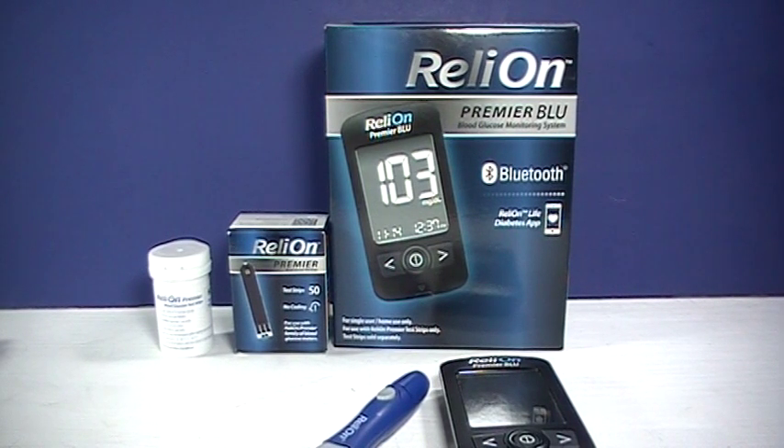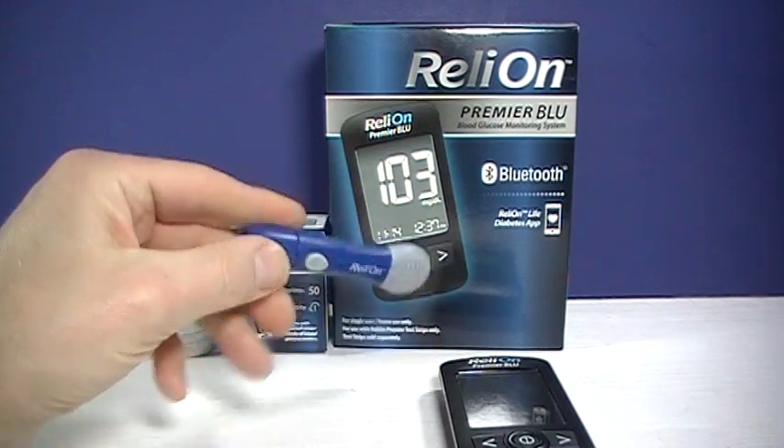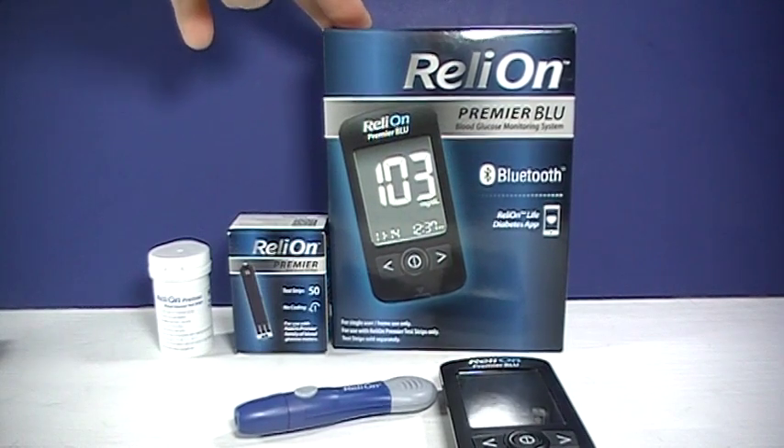Hi, this is Josh, pharmacist with PharmacistTips.com. Here I'm going to show you the RelyOn Premier Blue Meter. This I purchased at a Walmart. It's about $19.